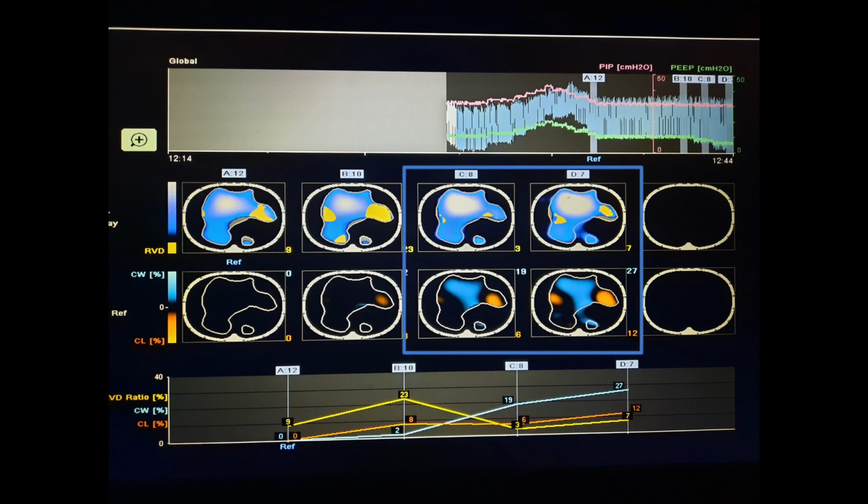The most important thing is to continue to redo multiple tests to make sure that there's a certain amount of reproducibility in the results.